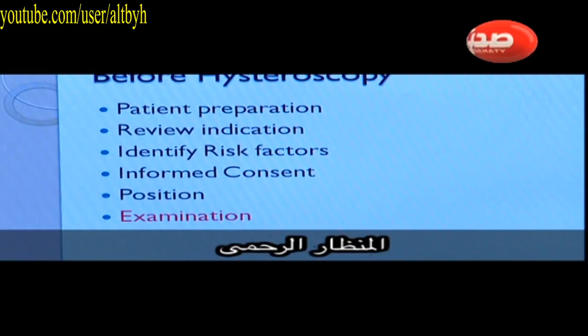Also, you have to be aware of the position of the patient before the hysteroscopy. She has to be in the lithotomy position, and this is very important. Examining the patient under anesthesia is very important as well, and you have to make sure of the position of the uterus, whether it's anteverted or retroverted, and also it's an opportunity to comment on the descent of the cervix and any prolapse, which can help in further management.